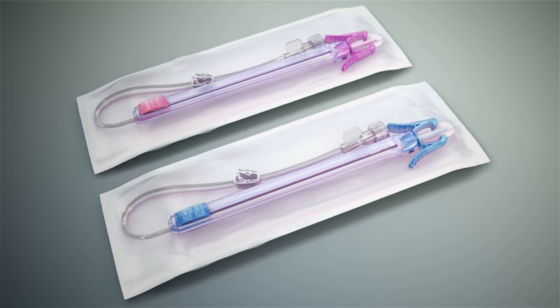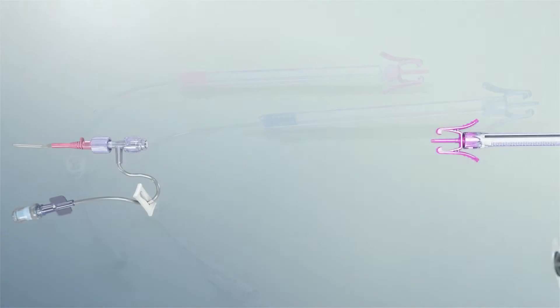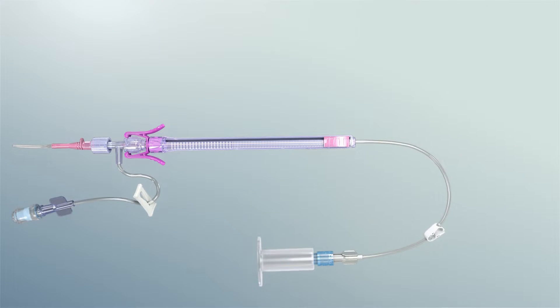PIVO is a single-use disposable device that temporarily attaches to a patient's indwelling peripheral IV catheter to collect a venous blood sample.